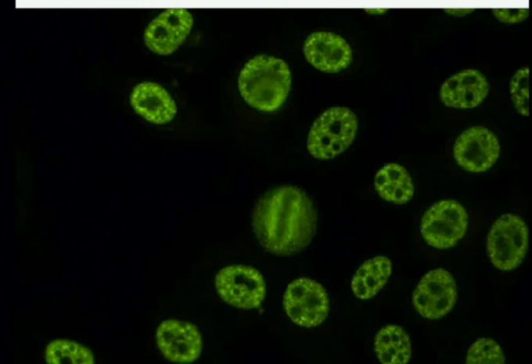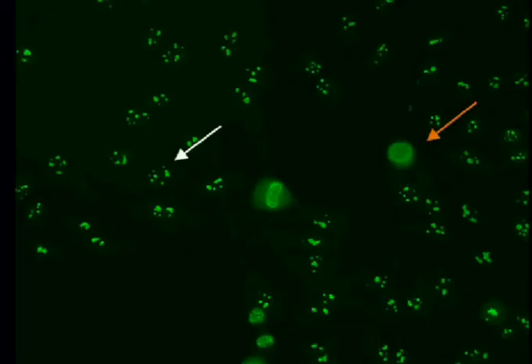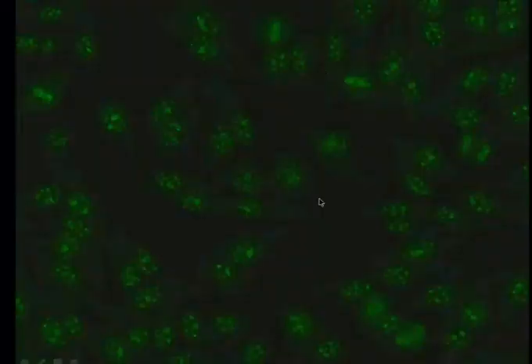It is found in Sjögren syndrome. Then the nucleolar pattern, antibodies to RNA. Then again, which pattern is here? Anti-centromere antibody, where the mitosis is stained, contrary to the speckled pattern. Okay. The anti-centromere antibody is found in systemic sclerosis.